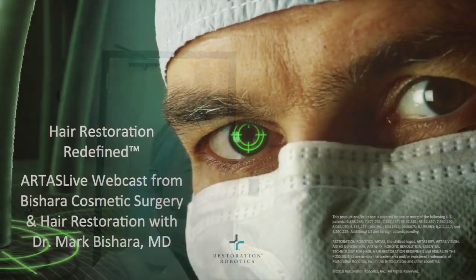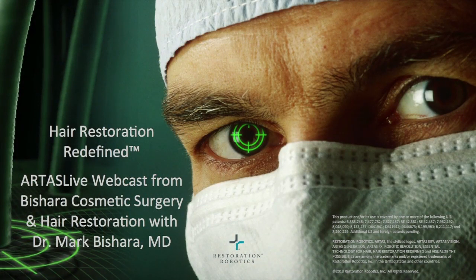As far as setup, there are default settings that come to the robot. We can change them, and we can save those default settings for our patients. We can save them just for the specific patient of the day, or we can save the default settings for the next day. So we don't have to come in and recalibrate everything from a 24-step process like we do once every 6 months. There's a streamlined version of getting set up in the morning, and that takes a few minutes.